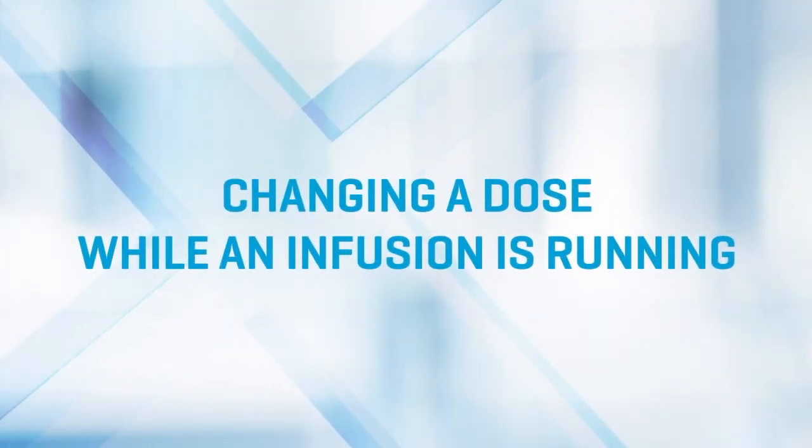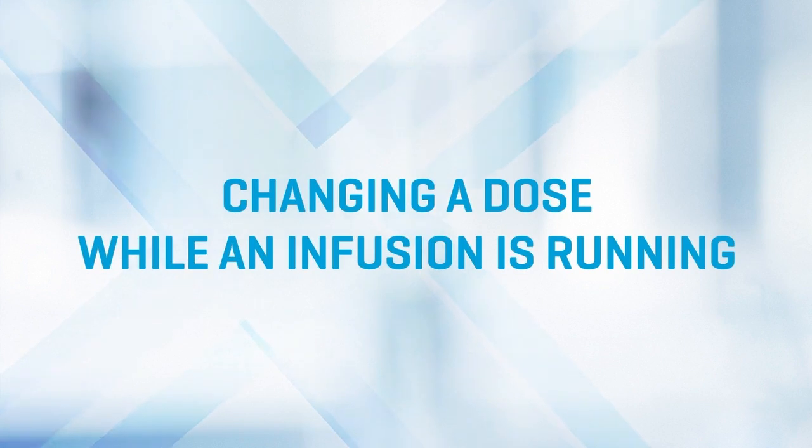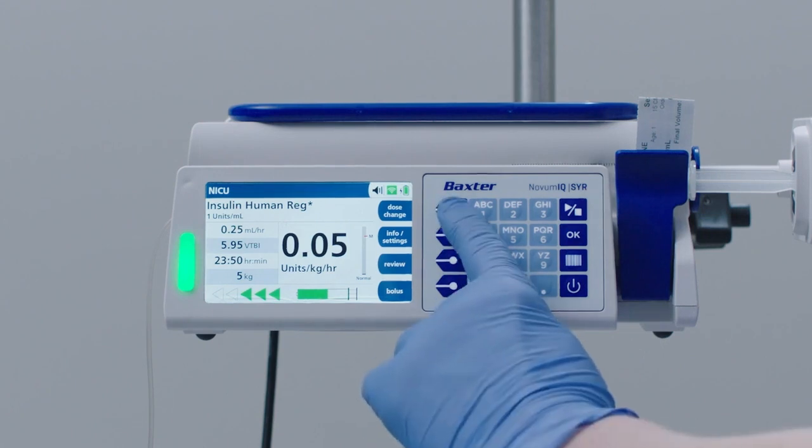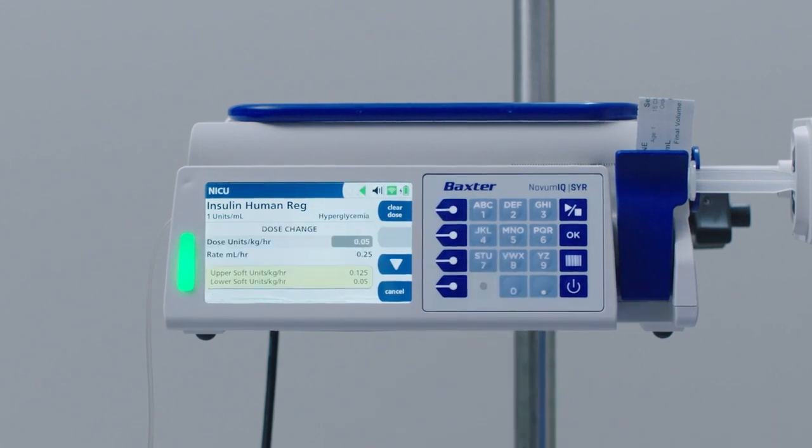Changing a dose while an infusion is running. A dose change option is available for drugs configured with all continuous dose modes except for milliliters per hour. To change a dose, press the Dose Change soft key at the infusion delivery screen. On this screen, you may press the Clear Dose soft key to clear the current dose rate.